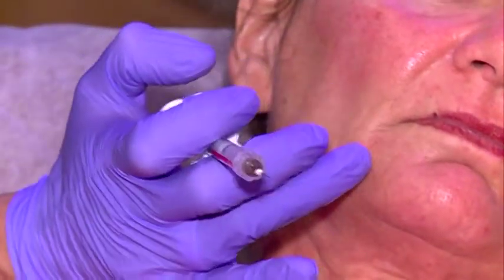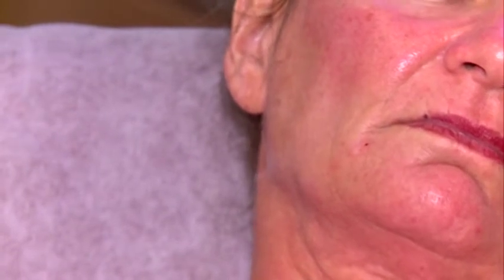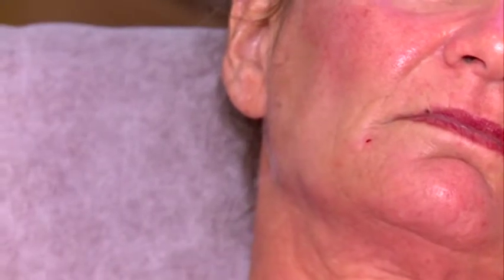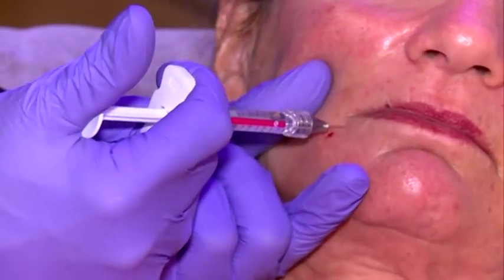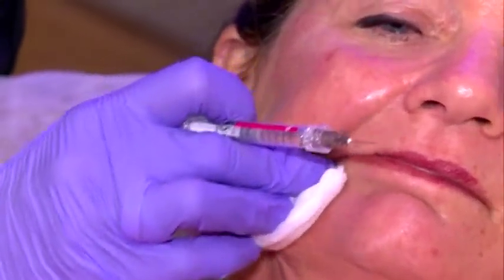And then you see, I'm not sure if you see this here, it's already lifted. With less than 0.2, a tiny bolus, you have a lifting and projection effect, and also a volumizing effect. And the nice thing with Belotero Intense is, I can also use it to elevate the corner of the mouth.